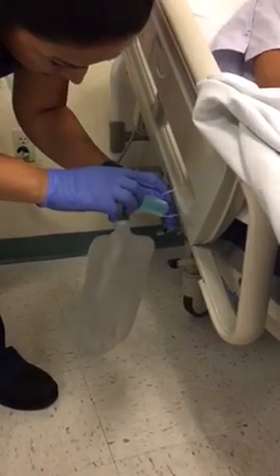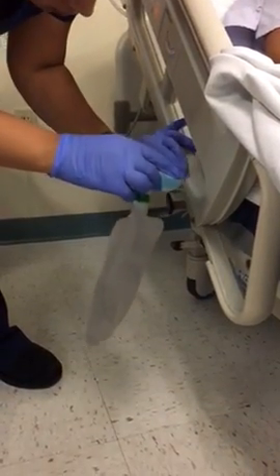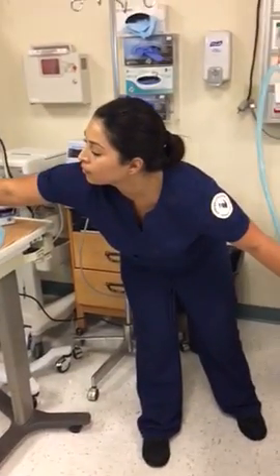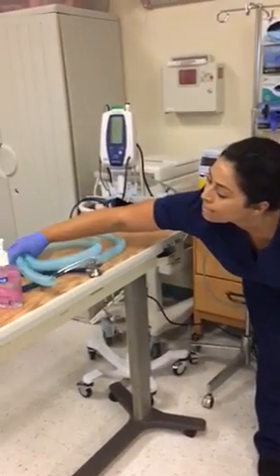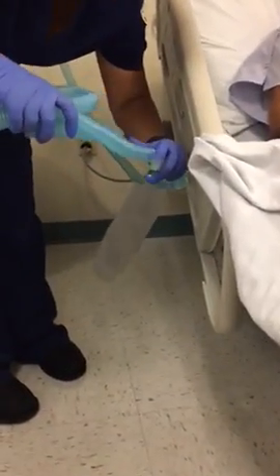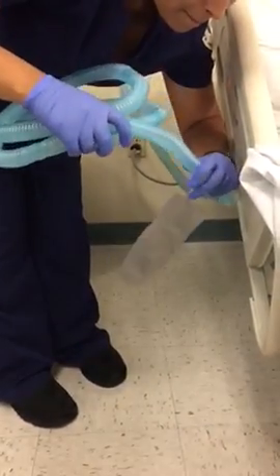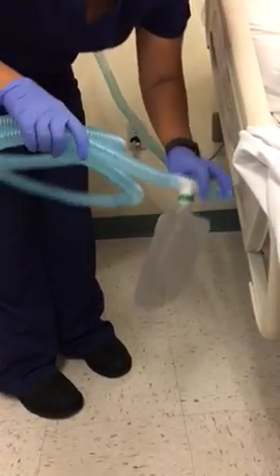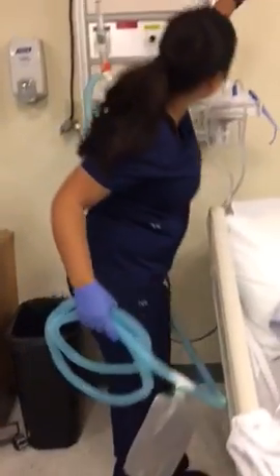So now it is attached, so I can pull on it and it's not going to fall. And next I can attach this tube. And there we go.